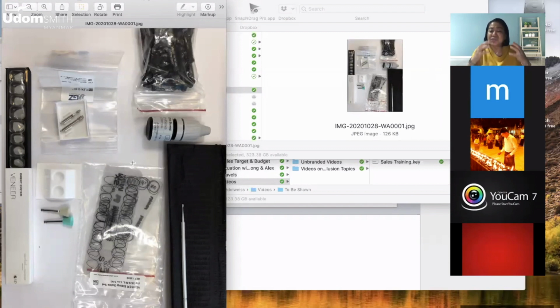Try first to follow the instruction of the manufacturer to the letter. Use the materials that they used. Now, after you get used to it and you already know exactly what to do, then you can do a little deviation if you want, and that is only if you want later on. But if you're doing it first, try to use the veneer bond, have the sizing guide, everything is already in it.